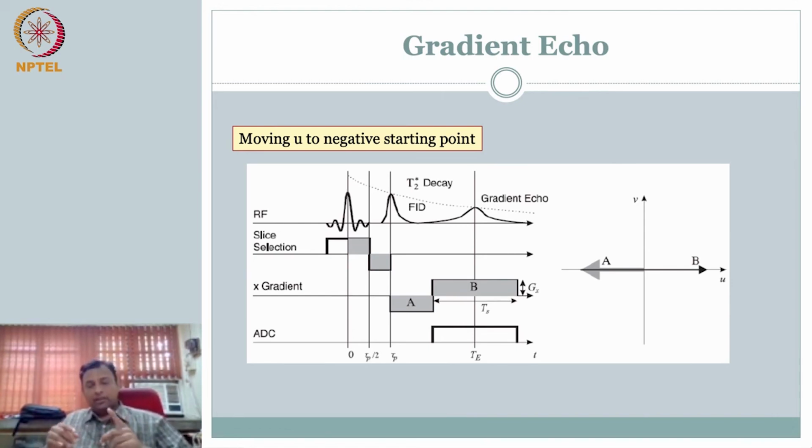Therefore, fundamentally the decay constant in gradient echo is T2 star, signal loss due to change in magnetic field strength, right? That is T2 star. Whereas your spin echo is based on T2. Very fundamental concept, but easy to get confused. But I hope you listen to this lecture a few times and get a feel for it.